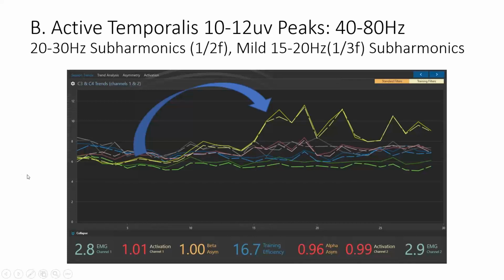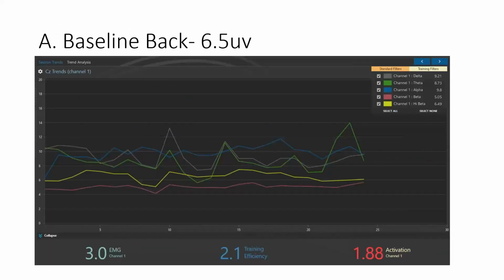So really, looking at the software, you can triangulate the likelihood of where the muscle tension is coming from, and eventually we'll include this in the software. We just need a little more data and a little more time before we put it in there, but you'll be able to have an image on the software that says this is the muscle group. We'll have a little head with little muscles on it, and you'll be able to see them light up, see which muscle group is producing it.